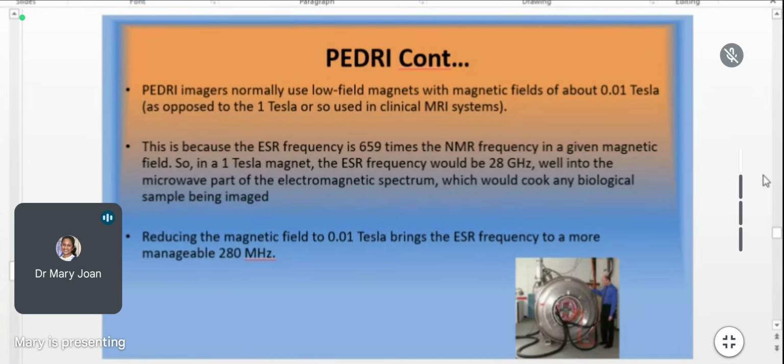So this is another thing which we need to understand. When we talk about MRI, we say there are no radiation effects. It's safe to use, there are no side effects and all. The thing is, there can be effects.